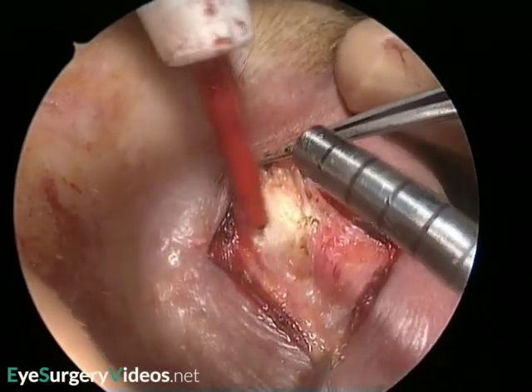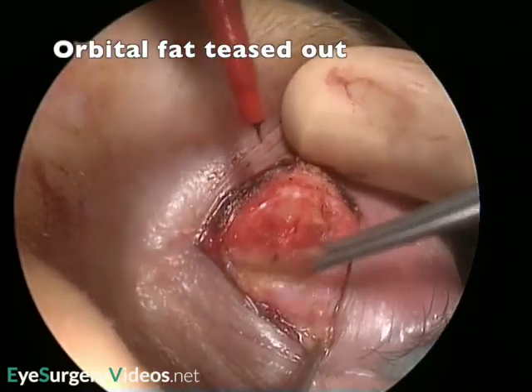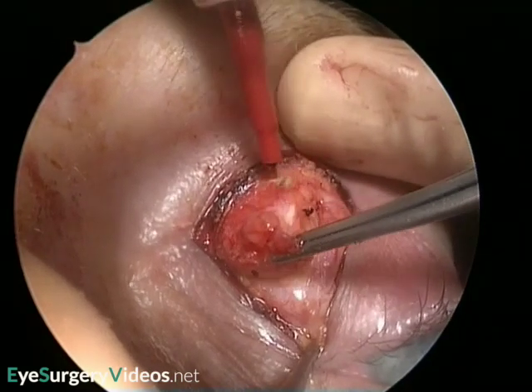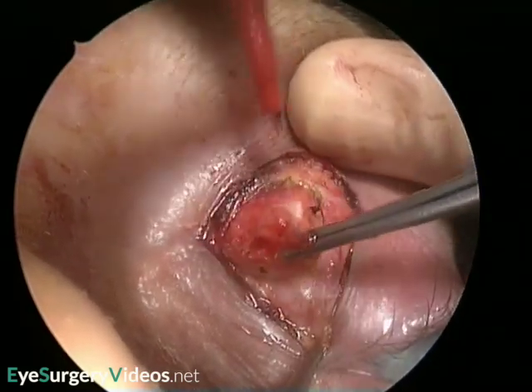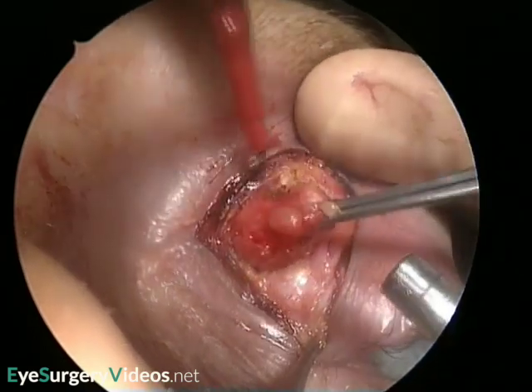The fat can be excised with cautery, as you see here, or alternatively clamped, cut and diathermy of the stump. Both techniques minimise the risk of bleeding, which if it does occur as the fat retracts, could result in retrobulbar orbital haemorrhage.